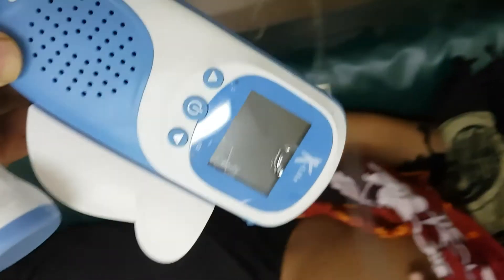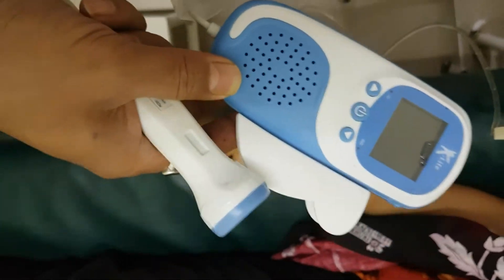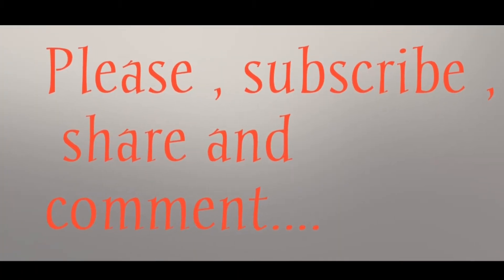Hi friends, this is a new video. I have met how to check the fetal heart sounds by a device called portable pocket Doppler machine. For that, I am applying a jelly-like substance on the tip of the Doppler probe.